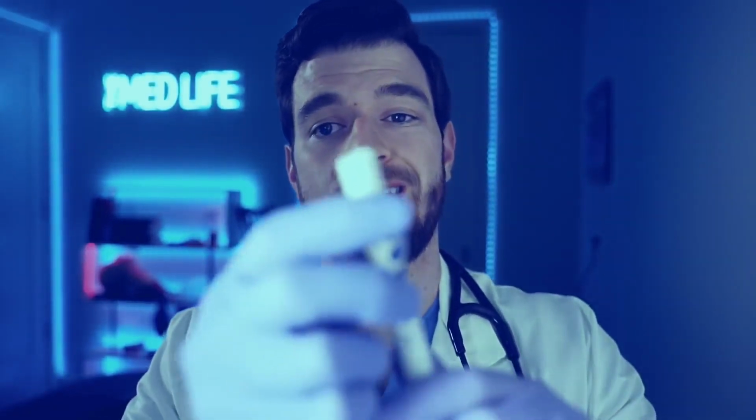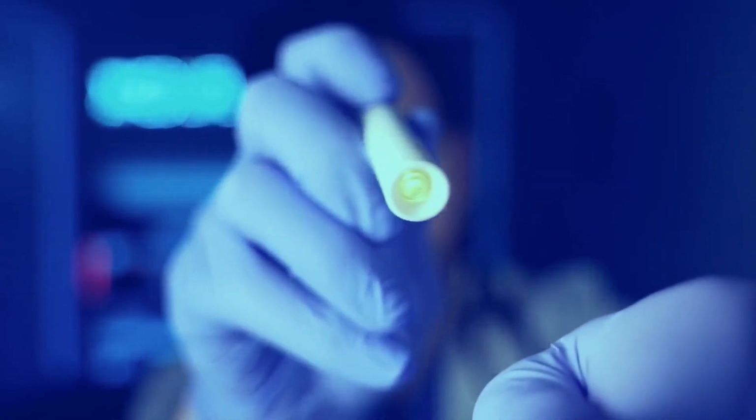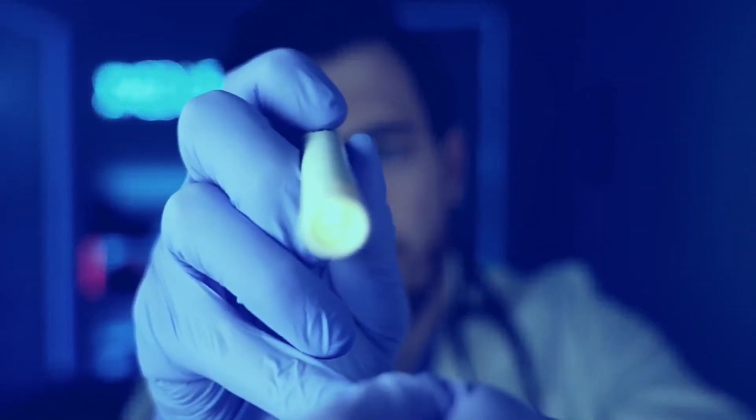Here's the paper. I'm just going to have you close your eye. Good. I'll put it on both sides here. And your eye just pulls the dye off of that a little bit. Now, I'm going to dim the lights a bit, and in doing so, you're going to notice a bit of blue color coming from the pen light here, okay? Again, it's going to be a bit more blue. Good. Turn the lights back up here.